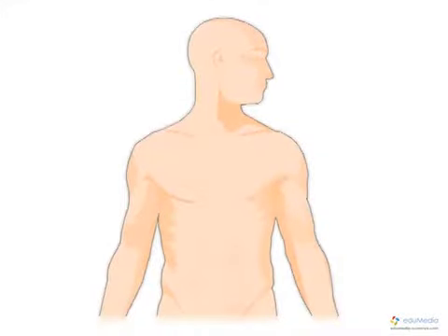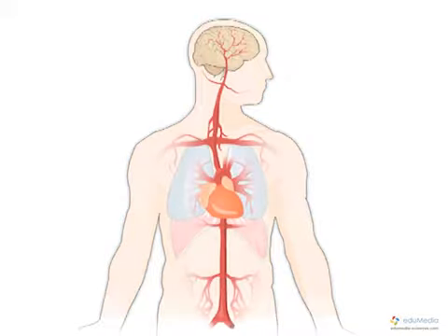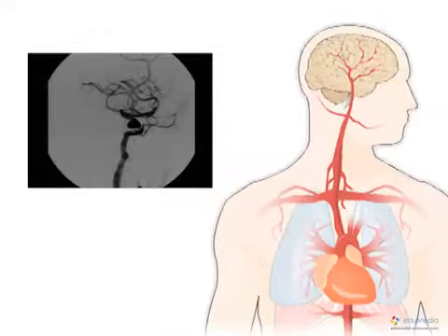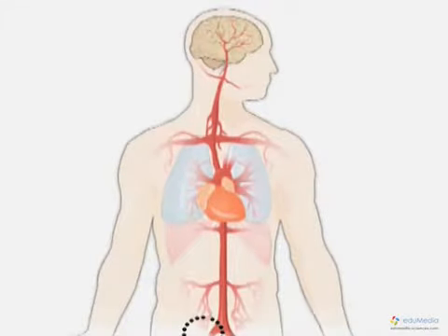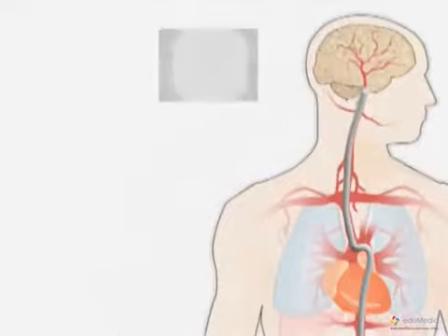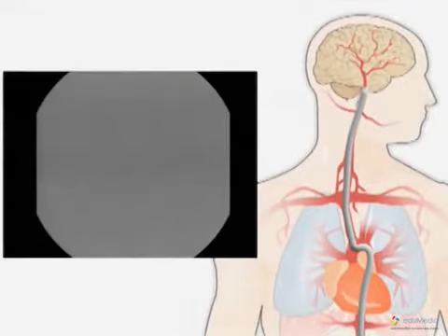The injection of a contrast medium based on iodine into the bloodstream makes it possible to see very fine structures like blood vessels. Thus, to treat an aneurysm in a cerebral artery, that is, a local distension of an artery in the brain, an incision is made in the groin at the femoral artery, and then a very fine tube called a catheter is introduced, which passes successively from the femoral artery to the abdominal aorta, then into the thoracic aorta, so as to go up through the carotid artery to the brain. That is when we inject the contrast medium.